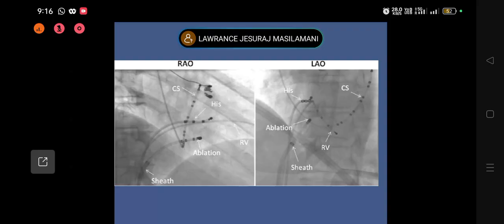There are catheters which take you septally. Some people use these catheters to take the catheter septally. I don't like them because they tend to take you a little higher. Mullins sheaths usually take you lower, which is easier for you to manipulate. If you want to go higher, you can always deflect your catheter and go up to the areas you want to ablate. While most of the other sheaths like SR0 or SL0 will tend to take you septally and to slightly higher locations. So I use a sheath in every one of my AV nodal reentry ablations.